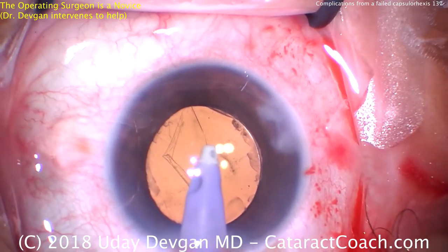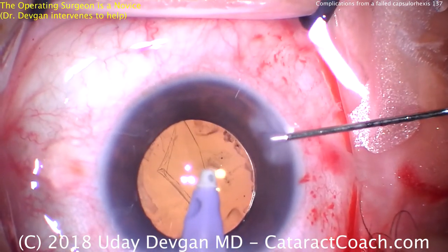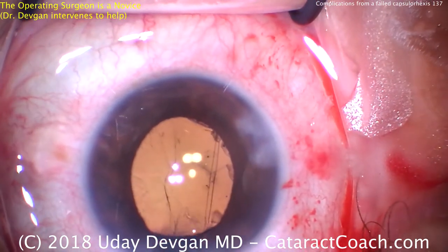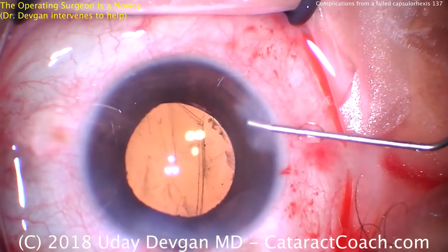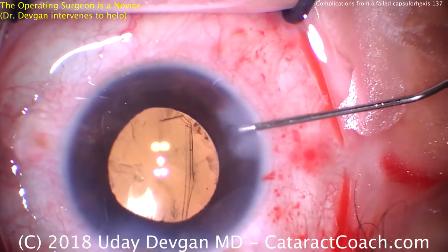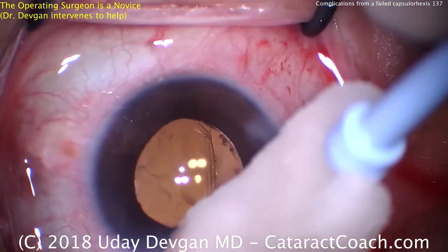Don't let the AC collapse. Let's come out of the eye carefully, and while coming out I'm going to inject BSS to prevent the AC from collapsing. Now we can seal up the incisions and call it a day. We've checked — we are very fortunate. There is no vitreous prolapse. The lens is very nicely positioned and actually quite well supported. Yes, there's that central slit opening in the posterior capsule, but fortunately it won't pose much of an issue.